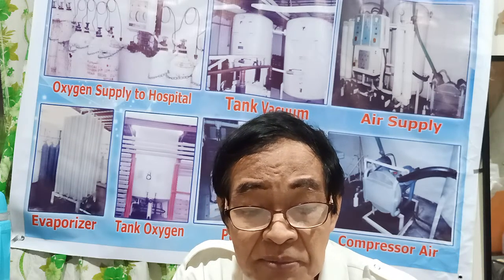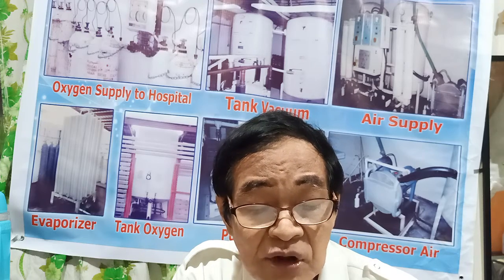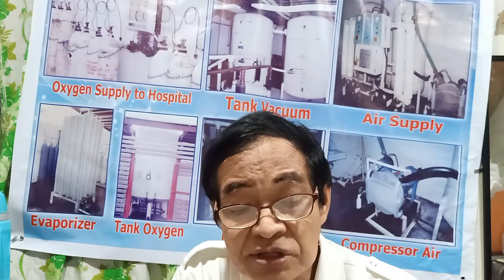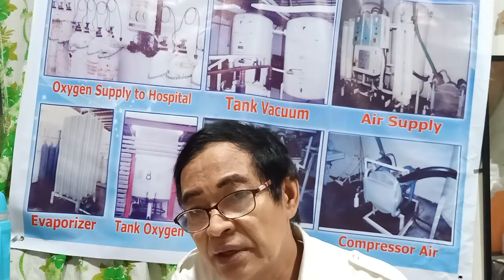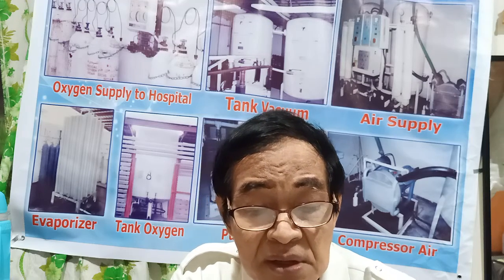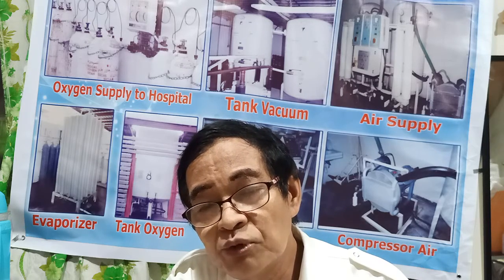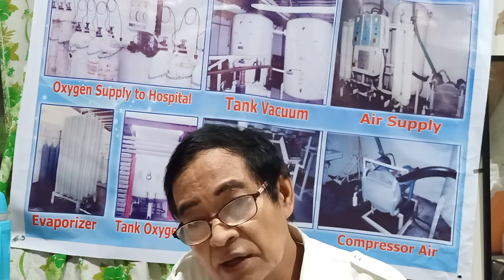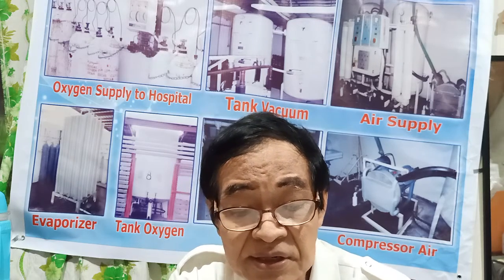Do not store flammable materials in the immediate vicinity of the tank installation. Be careful. Before installation, all materials should be covered and kept outside, because some of the hospital maintenance technicians preparing for installation are in danger if all the materials are there.